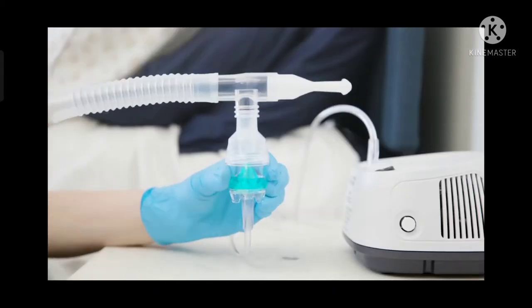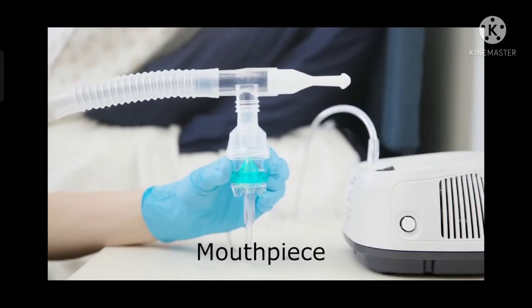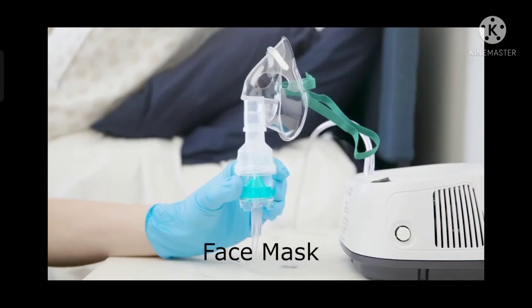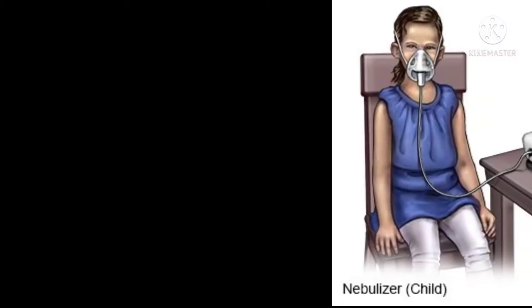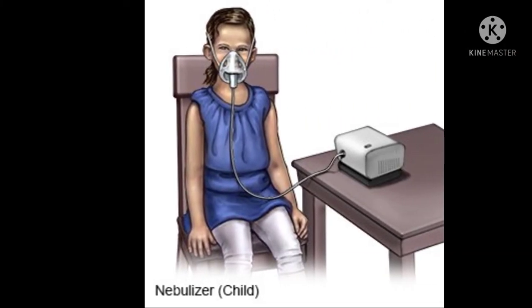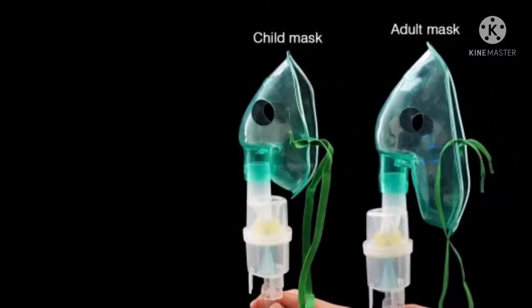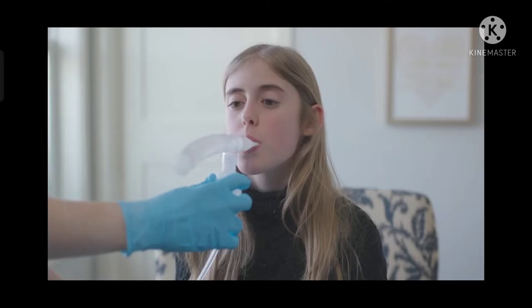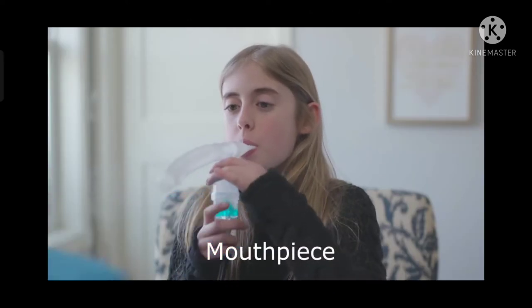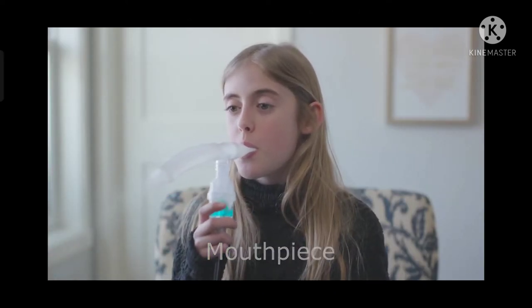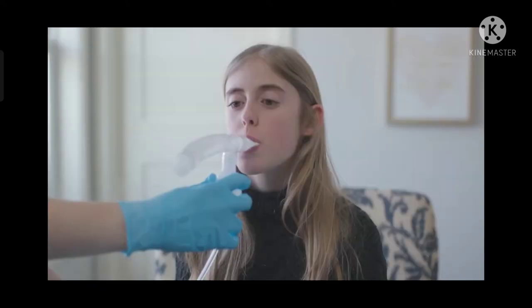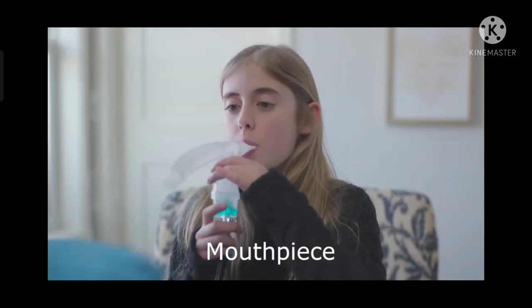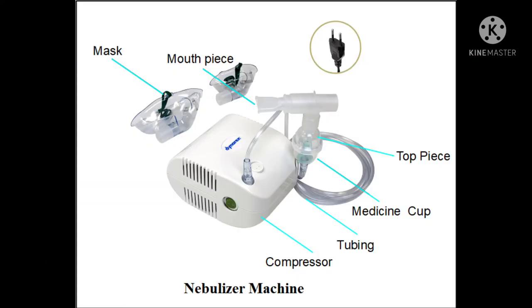The other end of the tubing can be connected to a mouthpiece or a face mask. Generally in children, a face mask is preferred, which is available in two sizes: one for a child and one for an adult. When a mouthpiece is used, we should place it in the mouth and ask the child to close the lips tightly.